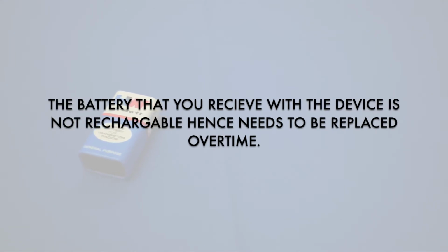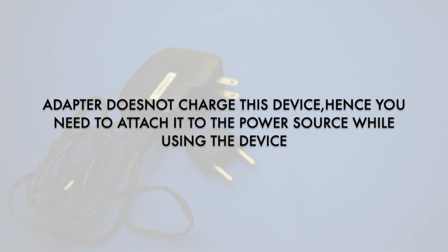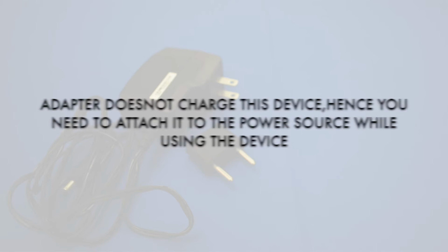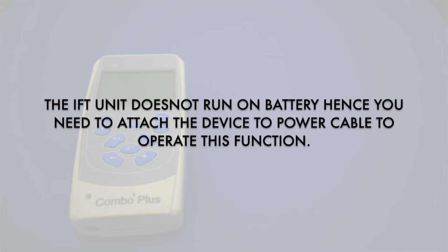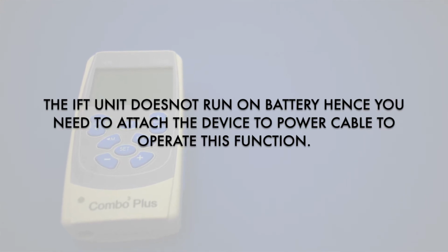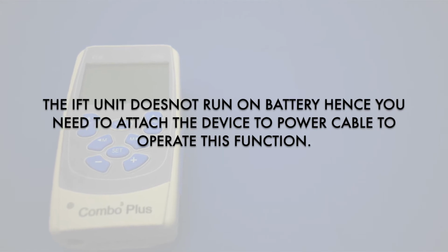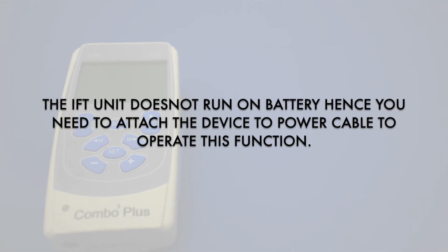The battery that you receive with the device is not rechargeable. Hence, you need to replace it once it's over. The adapter is another source of power to run this device, but it does not charge the machine. Hence, whenever you want to use the device, you either need to attach an adapter or the battery. The IFT unit of Combo3 Plus device doesn't run on battery and you need to attach the power cable to run it. Moving to the Combo3 Plus unit, as you can see, it has 2 output units.